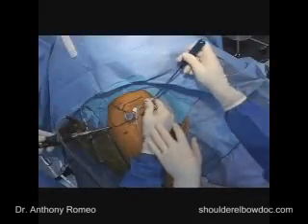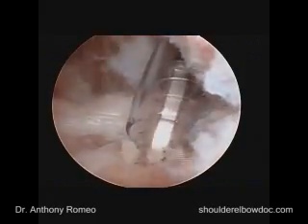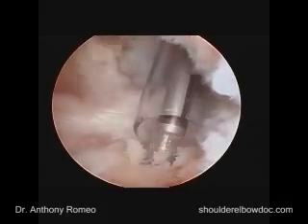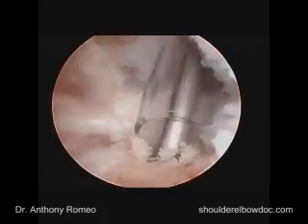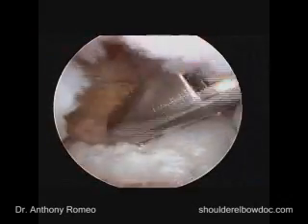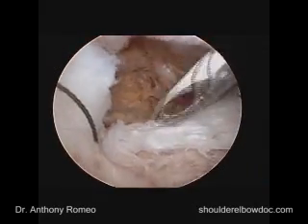Once we get the bone tapped, then we'll insert our anchor. This is a 5.5 fully threaded bioabsorbable anchor, and even with the tap, you can sense it's a very strong bone. We'll go down to the laser mark, and then we'll do the passing without the grabber, and this will get easier as we come further up the subscapularis.